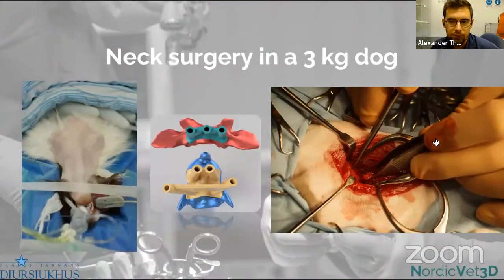This is another case, and it was Diva, who suffered from a C1, C2 instability, where the second vertebra was unstable and subluxated from the C1.